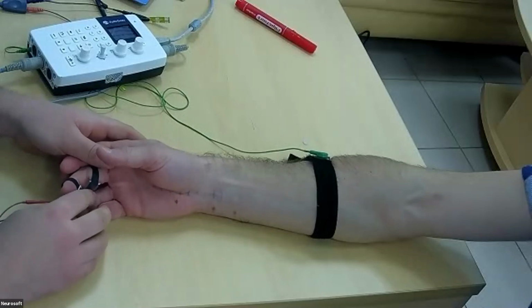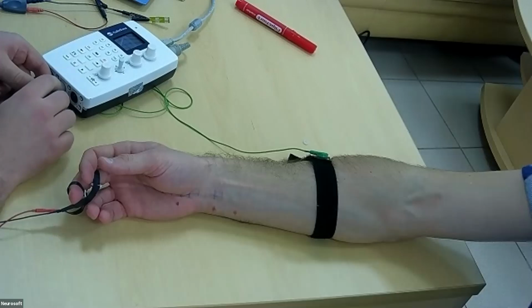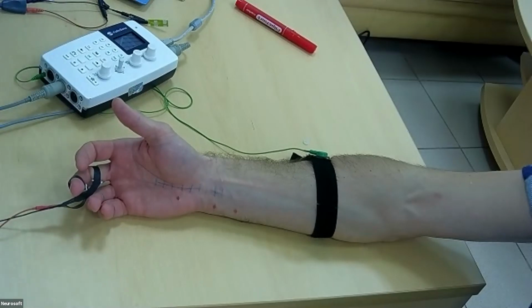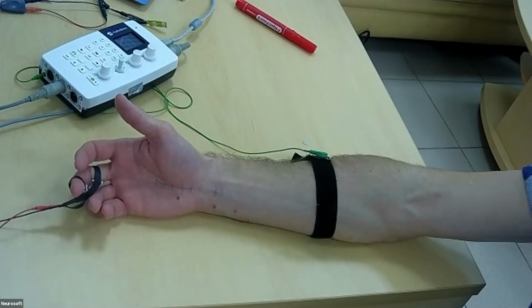By default all sensory nerve conduction studies are set in second channel in this machine. So we will stimulate with a bar electrode. We can leave our ground electrode at the same place.